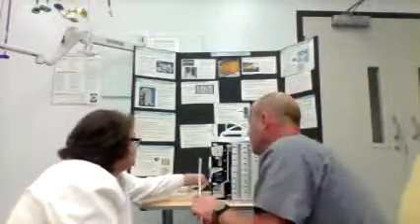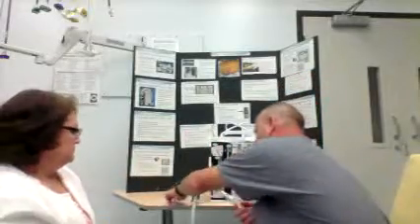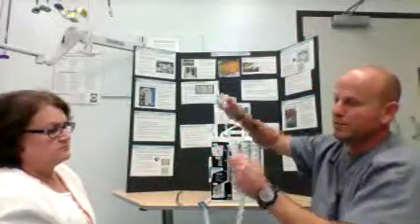So when the provider inserts it and he's ready to go, this tube will be in the patient. All you're going to do is remove this top and hand it to the provider, and he'll hook it up. That's all you have to do. It's very simple to assist in this procedure. If for some reason you drop this on the floor and it becomes contaminated, you don't wipe it off. You just go get another one. Go get a new system. This tube goes directly into the chest cavity. It has to be maintained sterile. So that's all there is to assisting a provider in inserting a chest tube.